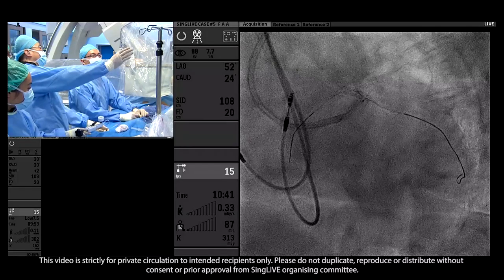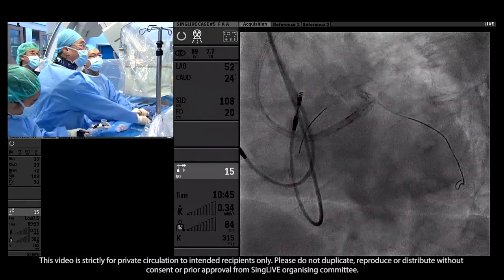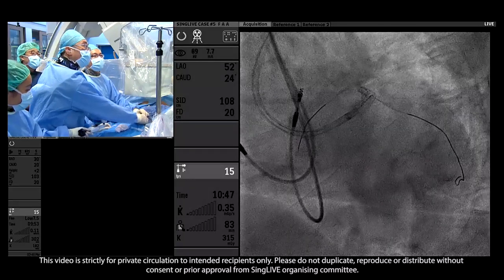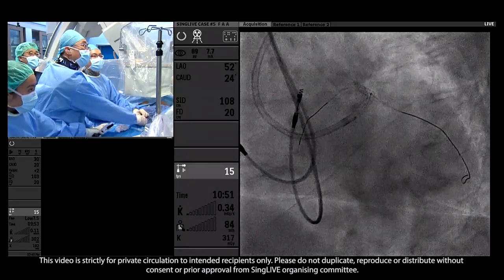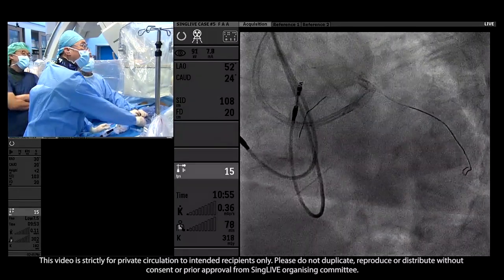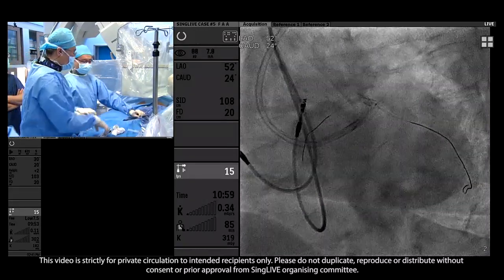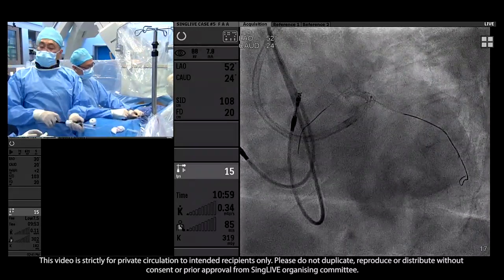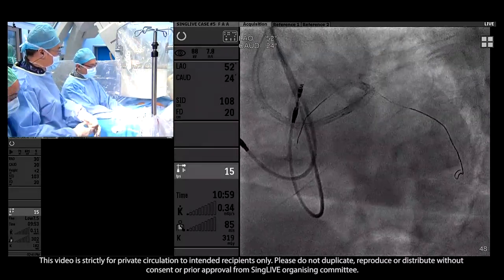So we need a three after the stent. This is 2.0, but this is a used 2.0. Wow. Okay, a used 2.0 challenge. The angle is acute, and I think there's some new one. Or maybe a 1.5? Yeah, 1.5. Well, 1.5 would be okay. A smaller balloon may help. 1.5, new one.